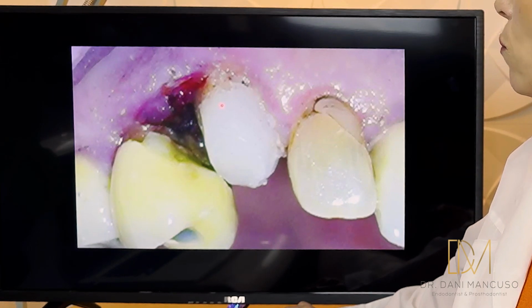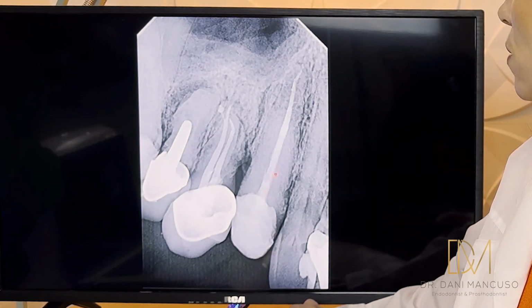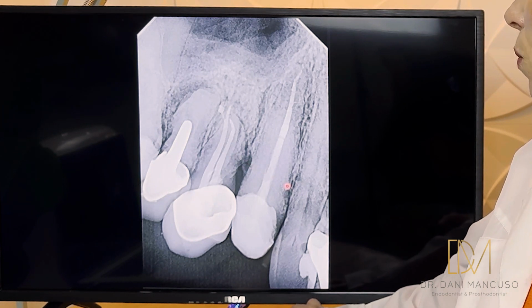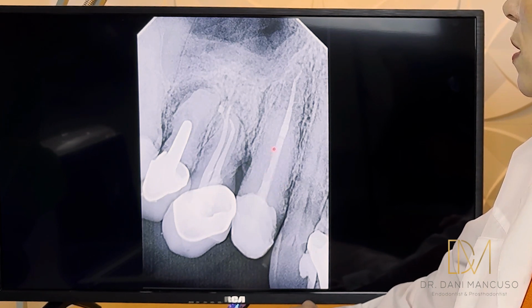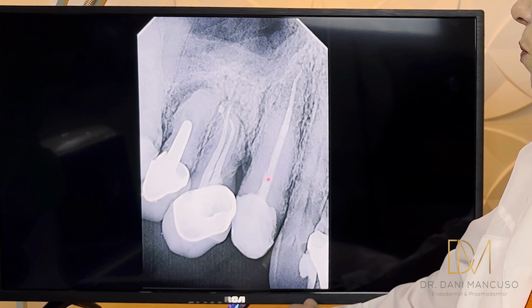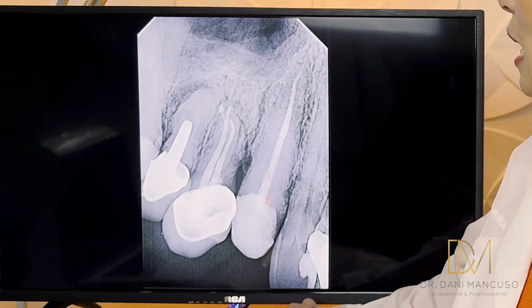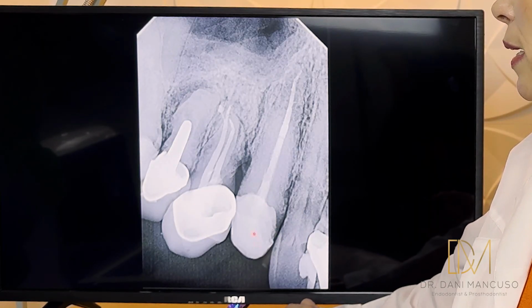So we then did the root canal treatment, as you can see here. And remember, I discussed that the bone level was okay. I chose the fiber post and took a very conservative approach, not enlarging too much cervically, to preserve enough tooth structure. I selected the fiber post which matched the canal, instead of preparing the canal to match a fiber post, and did the core build-up.